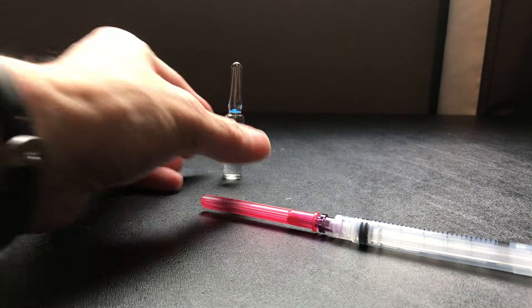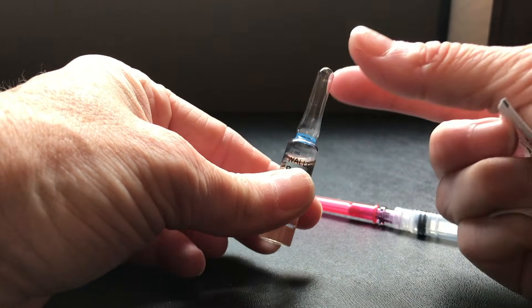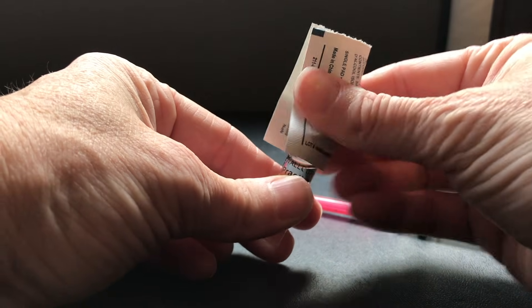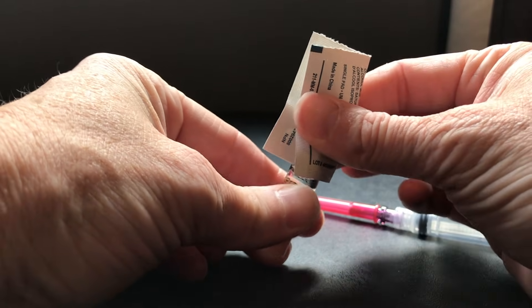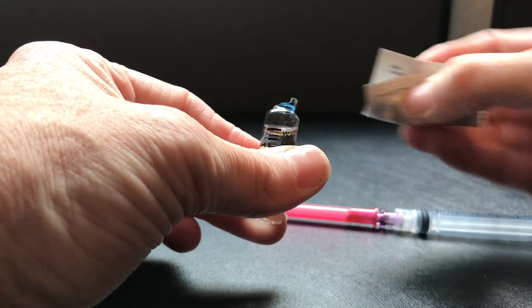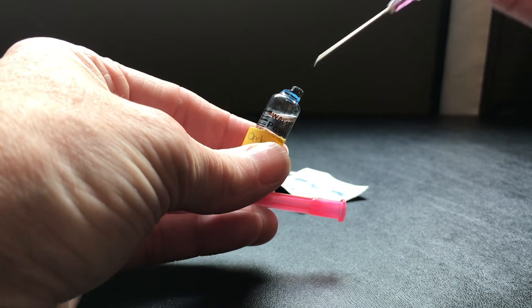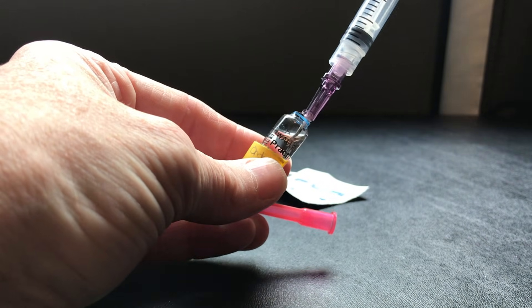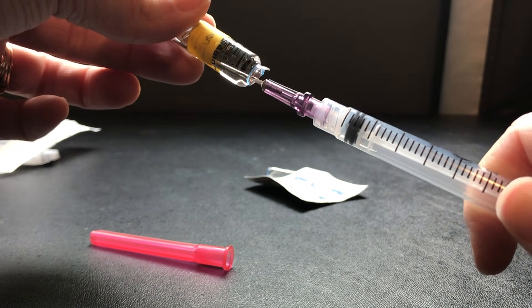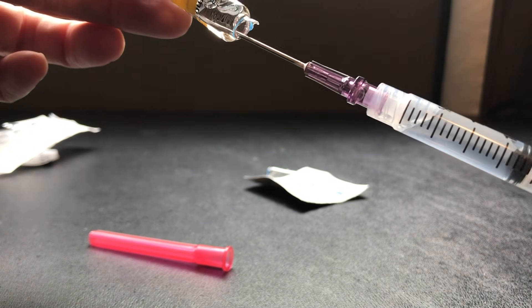To open the ampoule — sometimes we end up cutting ourselves, so if your facility has a plastic sheet for this, great; if not, I use an alcohol swab to cover around the neck. I push with my thumb away from me so it opens cleanly. Discard the sharp tip, then grab my blunt fill needle, insert it, and withdraw — I can actually turn the ampoule upside down and withdraw my 2 mils.